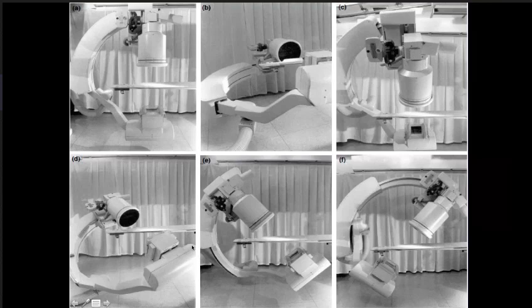And you can add cranial tilt. When the X-ray tube goes caudal and the image intensifier goes cranial, you get what you call a cranial tilt. You can do cranial tilt with any degrees of obliquity. That is, you can do cranial tilt in RAO or LAO or in a plain AP view, or you could do the reverse in a caudal view.